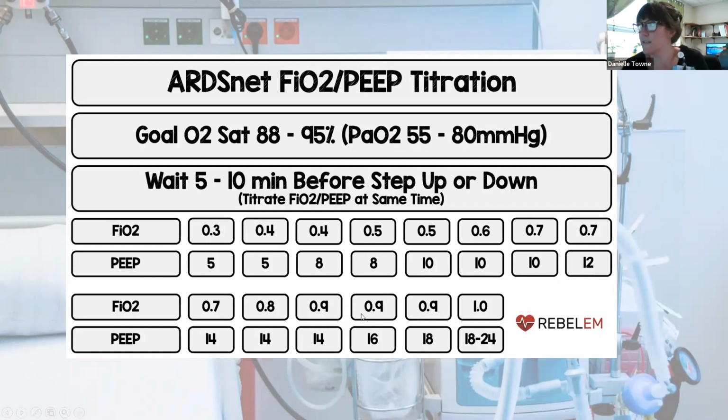If you use something like an ARDSNet table, this is one that's been super popular, especially with COVID, because we see a lot of our COVID patients develop ARDS. You can actually see a stepwise increase in both FiO2 and PEEP help patients better oxygenate. Rather than just going straight to 100% on your FiO2 and a PEEP of 5, which you see almost consistently on every newly intubated patient, it has you step up. Okay, if I'm at a PEEP of 8 and 50% FiO2, the next step, if I'm still hypoxic or haven't reached my goal, is to step up on my PEEP. Now that I've done that, I'm going to step up on my FiO2 and work your way stepwise up there. And it does work very nicely.